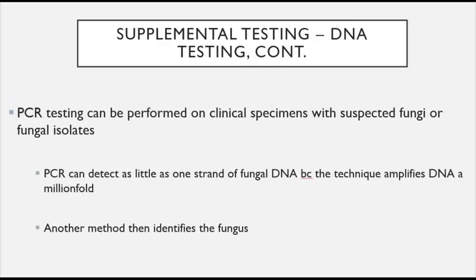Also, PCR testing can be performed on clinical specimens with suspected fungi or fungal isolates. PCR can detect as little as one strand of fungal DNA because the technique amplifies DNA a millionfold. Then another method can be used to actually identify the fungus. This concludes part 2 of our mycology lecture on laboratory methodologies.